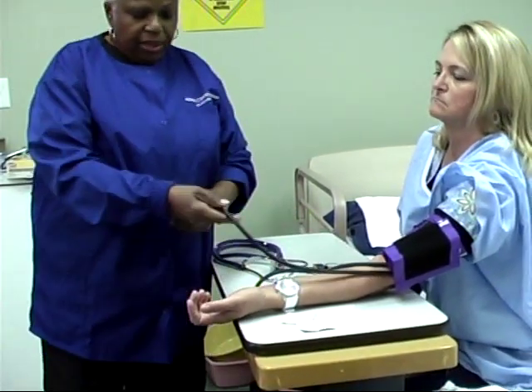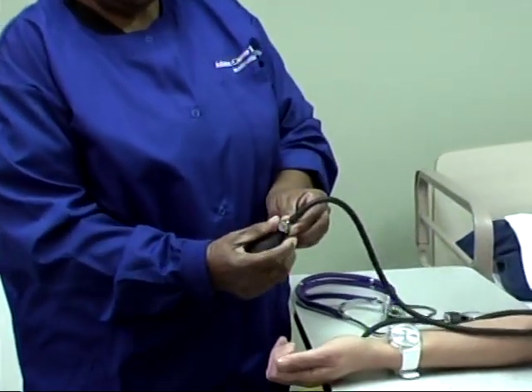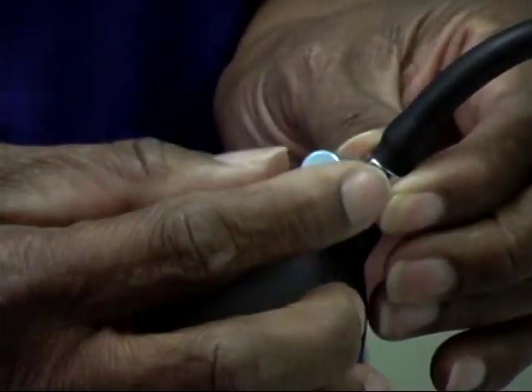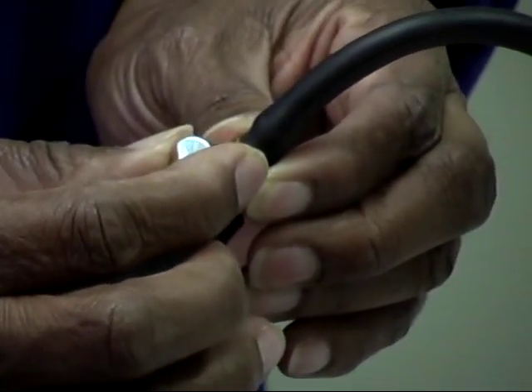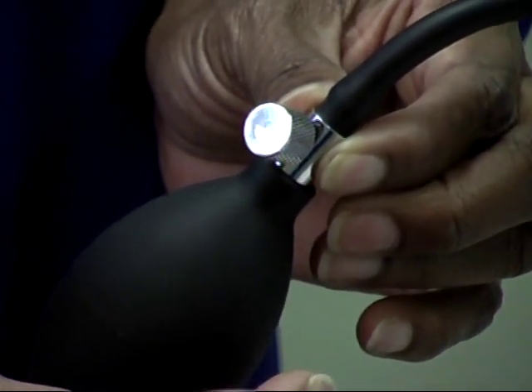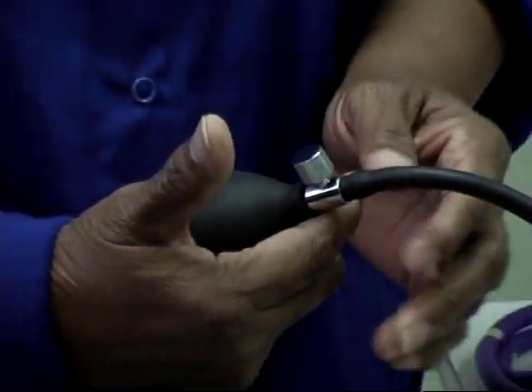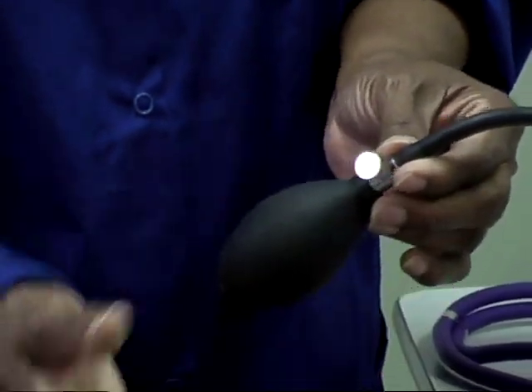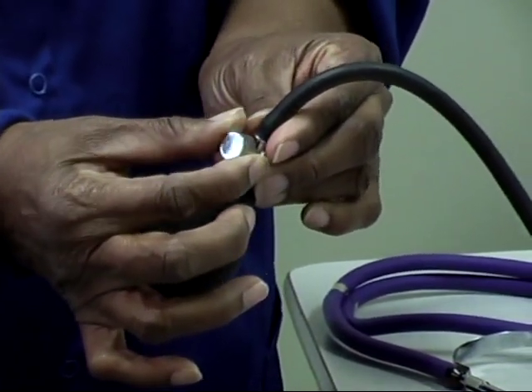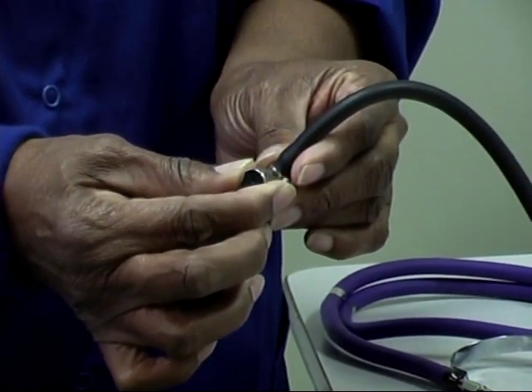To handle this, you will hold this ball in your hand, then turn this little lever to the right until you feel a little resistance. Once you feel that resistance, pump it up between 160 and 180. Then start releasing the air out slowly by turning the lever to the left and let it go out slowly.